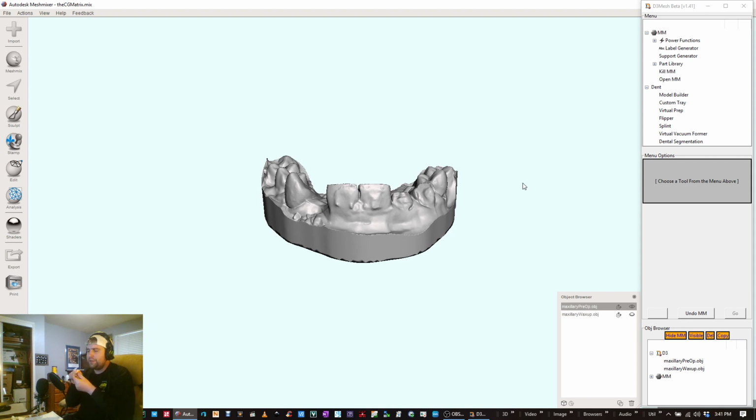And it's got this perfect little metal tip like flowable composite does. But it's meant for bigger, kind of bulk fills, I would say, and core buildups and things like that. It looks great and polishes well. Okay, cut to the chase. Puts this thing on. Puts little tiny perforations onto each tooth where the wax-up was.